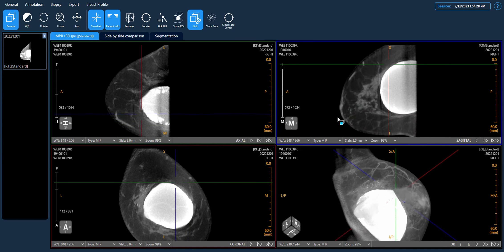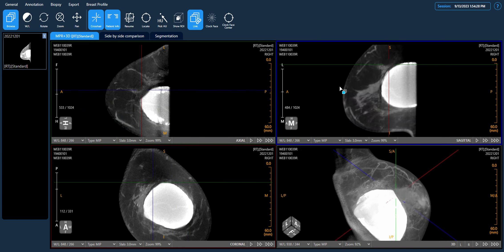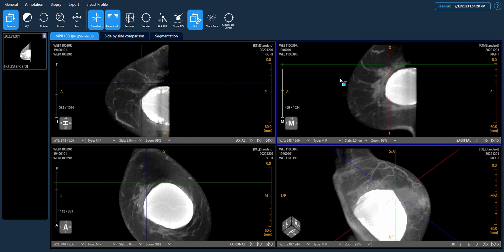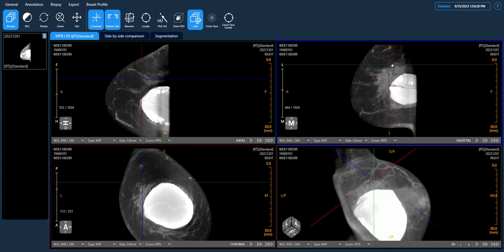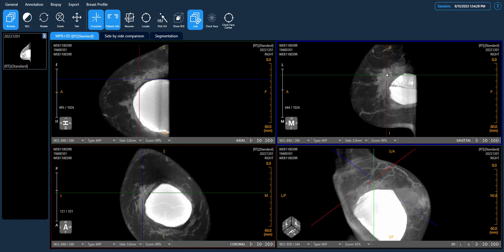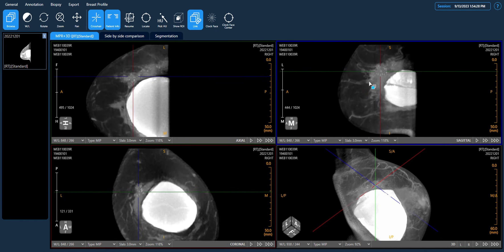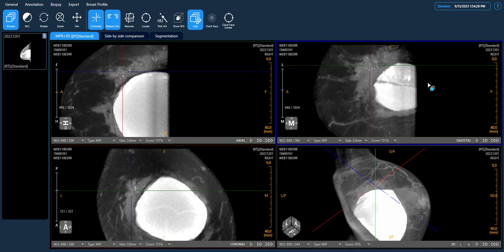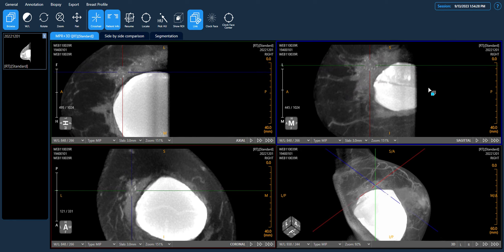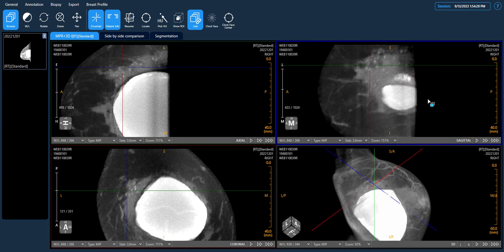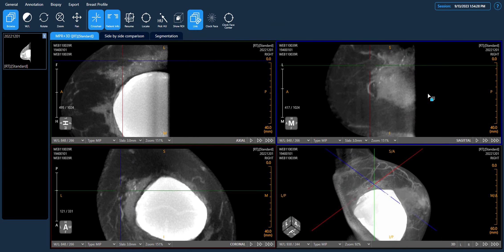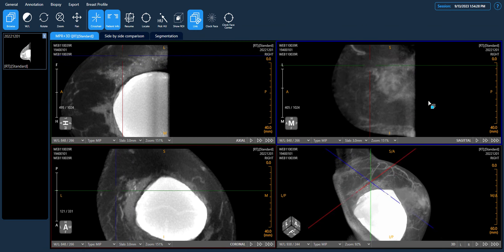As we proceed, we start to notice some microcalcifications in the upper quadrant, right next to the implant. We can zoom in to see more details. These calcifications are generally fine and pleomorphic, measuring around 100 to 300 microns in size and exhibiting a segmental distribution.